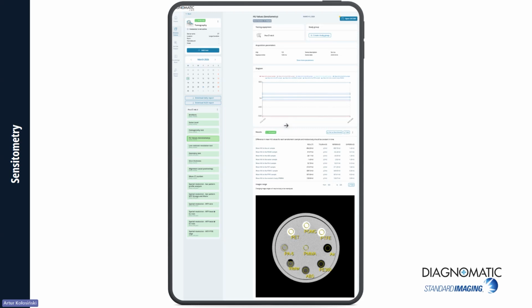When we are making the constancy checking on the timeline, we can see if it's always the same values or something has changed. So when something is changing, we should be aware that something's wrong with the machine, and we should take a closer look at the machine.